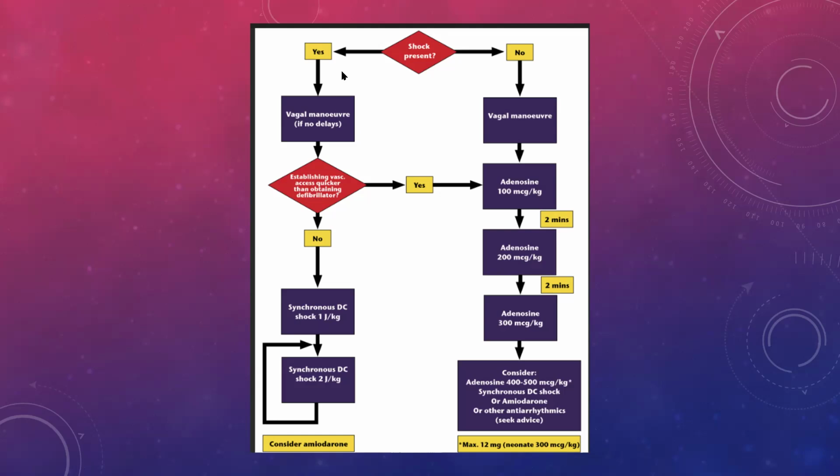So, you guys haven't seen it. At the end of this lecture, I was planning to do it on a later lecture, but I'll actually put it up now. There's a wonderful video that I found that explains it from top to bottom, how it works, how you set up the machine and things like that. It's basically defibrillation, but it's defibrillation where we are trying to stop the heart when it's contracted at its hardest, in other words, at the peak of the R wave.